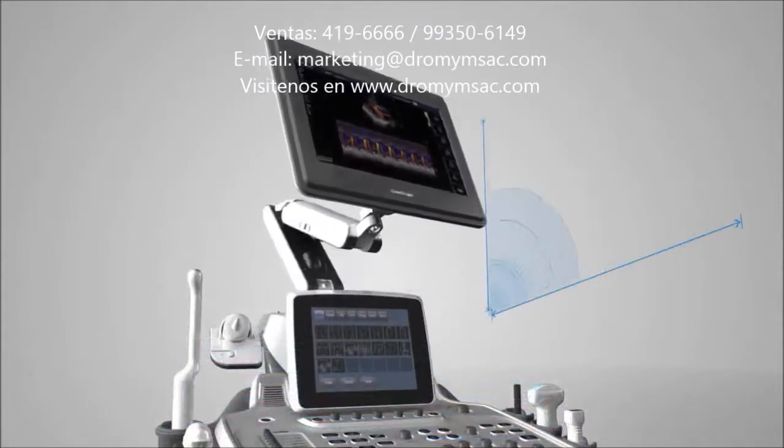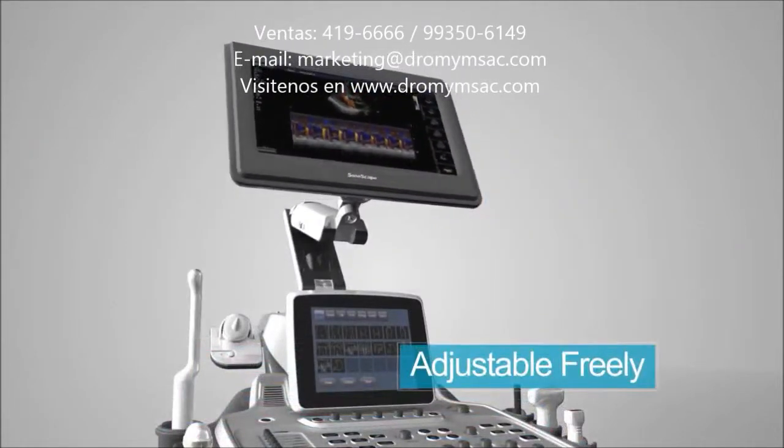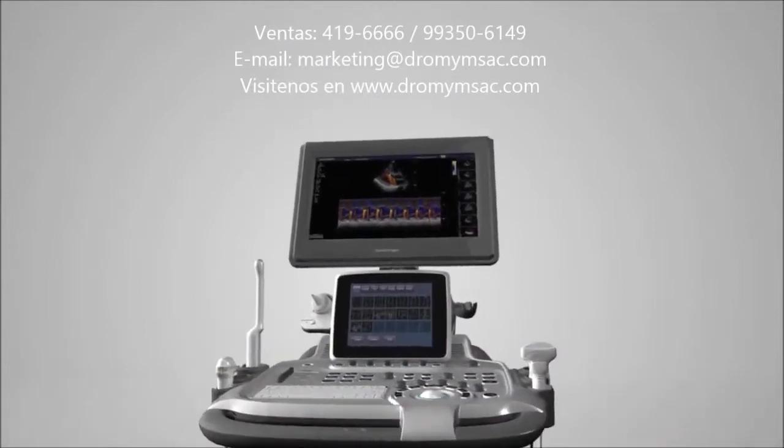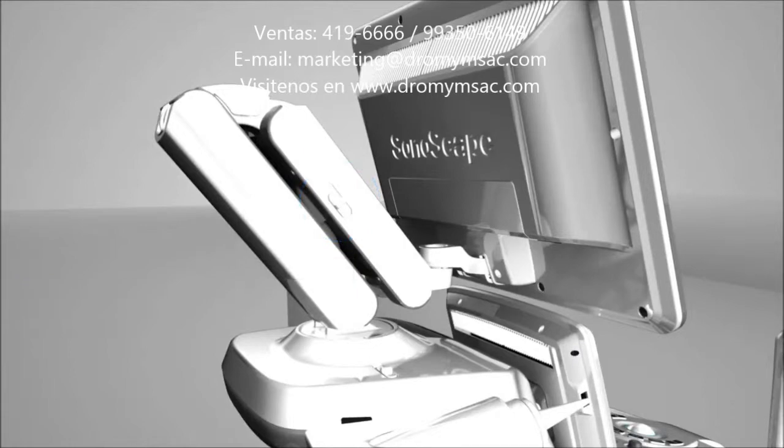S40 is equipped with a freely adjustable 19-inch HD LCD screen, minimizing vision fatigue. The arm can be adjusted around freely, or you can firm it by locking.